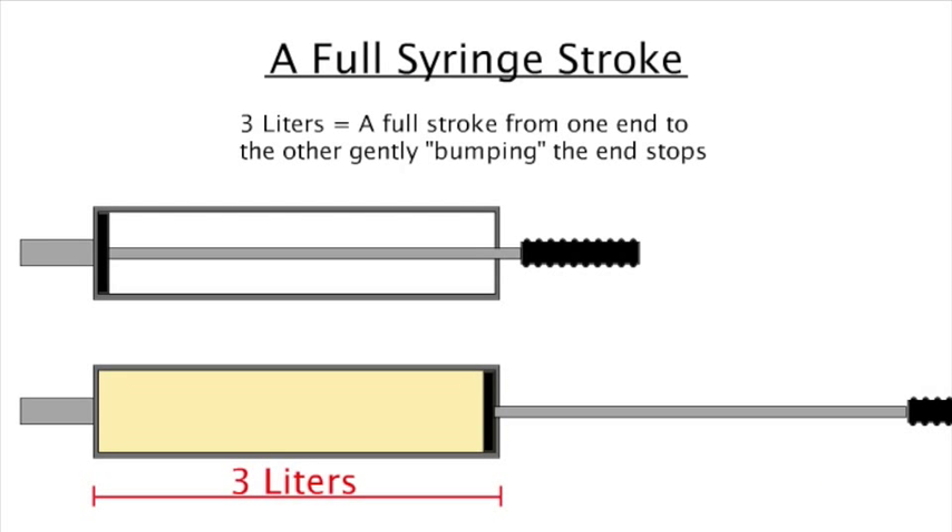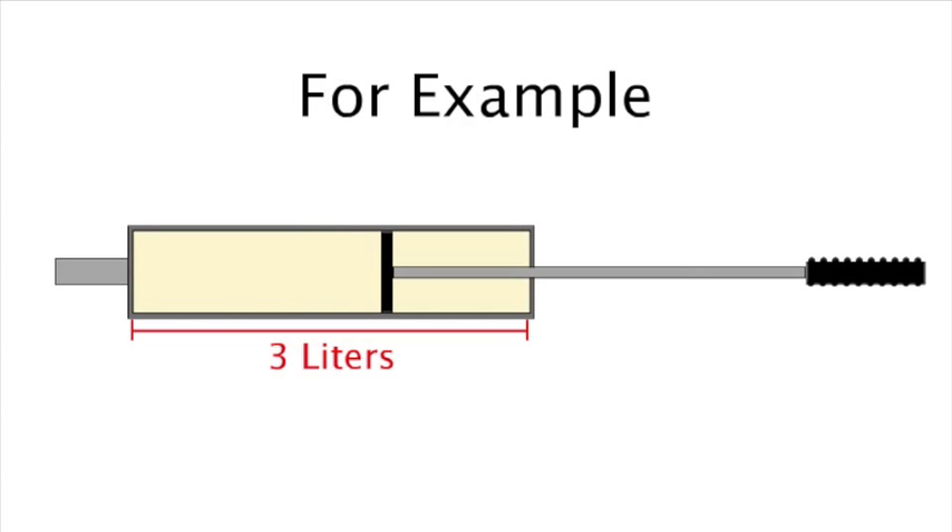The syringe on the top is in the start position for an inspired stroke and the bottom one is in the starting position for an expired stroke. Notice how the head of each piston is resting against the inside edges of the syringe. Here is an example of a complete inspired stroke — listen for the bump. And now an expired stroke — again, we hear the bump.